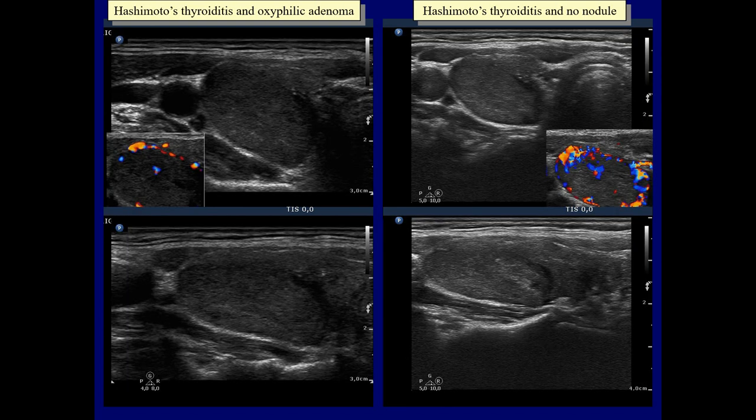and even the intralesional borders are ill-defined, which makes the sonographic pattern cloudy. The sonographic presentations are almost identical; both lesions could be nodules in a pathological sense or could not be. The two cases differ in the presentation of the borders: the right lesion presents an ill-defined part of border on the ventral surface, while the borders of the left lesion are all along sharp.